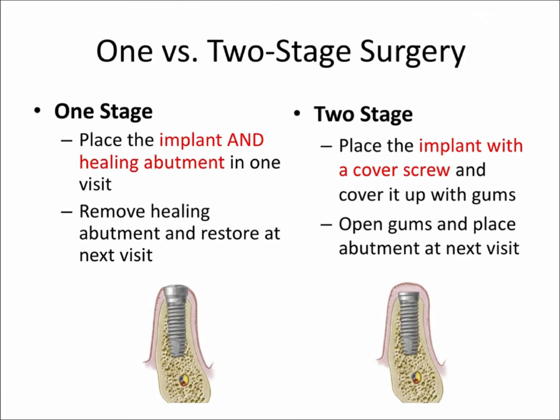If you have poor primary stability, so say we're working in the posterior maxilla, and we want to keep all occlusion off of it. So we would place this cover screw, and so we make sure that there are going to be no biting forces on the implant while it's healing and secondary stability is taking over.